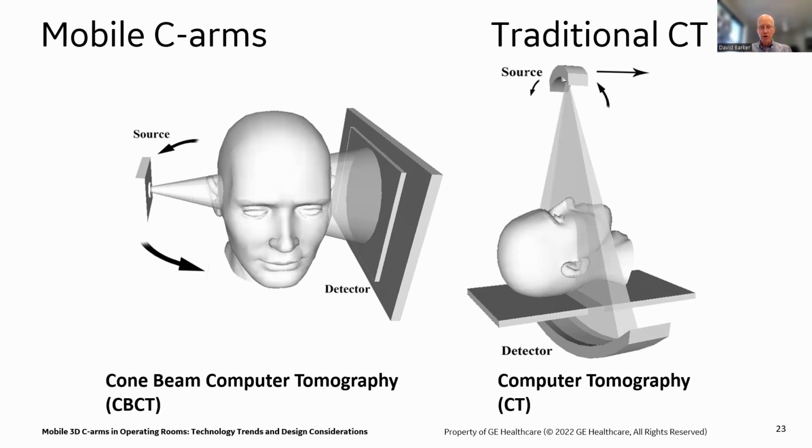Now, for this to work, for cone beam CT, what you need is at least 180 degrees of travel plus the width of the detector in order to get all the geometry that you're going to need to fully define the 3-dimensional volume. And if I can get more than that, then I start to minimize the chance of artifacts coming into the calculations.